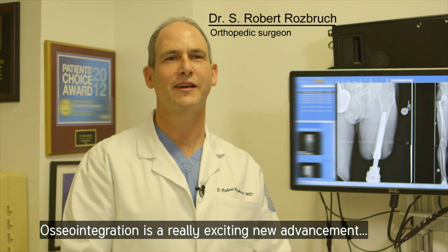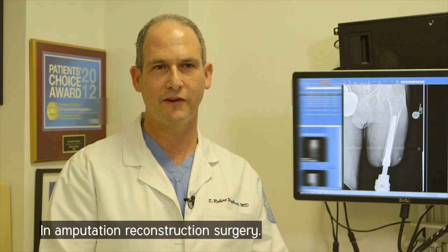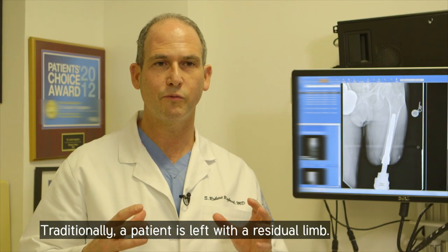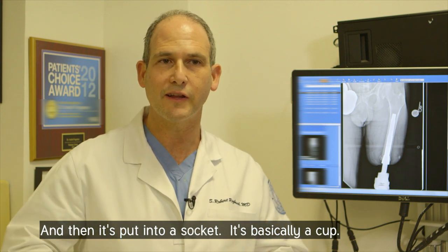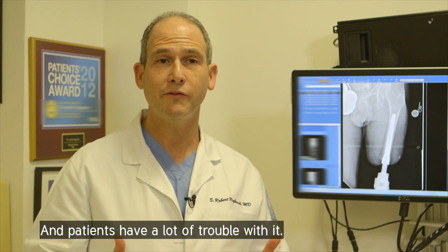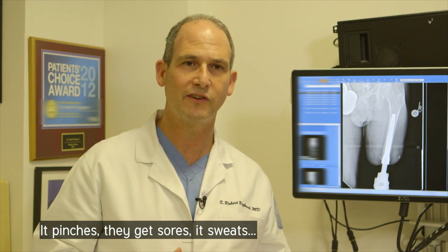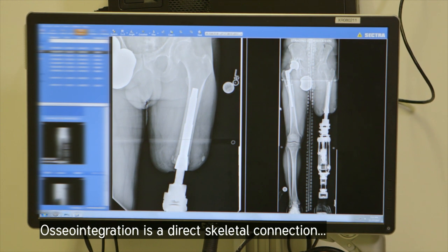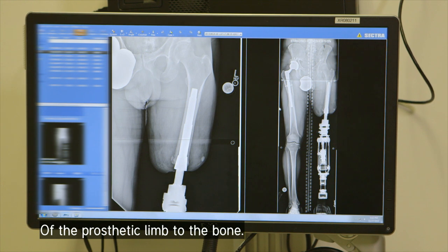Osseointegration is a really exciting new advancement in amputation reconstruction surgery. Traditionally, a patient is left with a residual limb and then it's put into a socket — it's basically a cup. And patients have a lot of trouble with it: it pinches, they get sores, it sweats, they slide around in the socket. Osseointegration is a direct skeletal connection of the prosthetic limb to the bone.